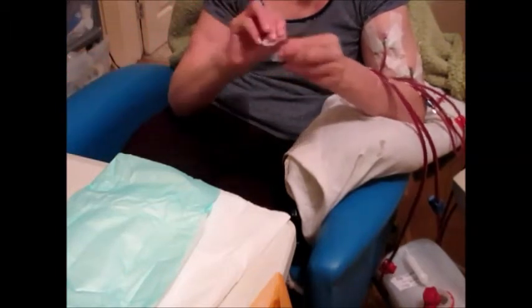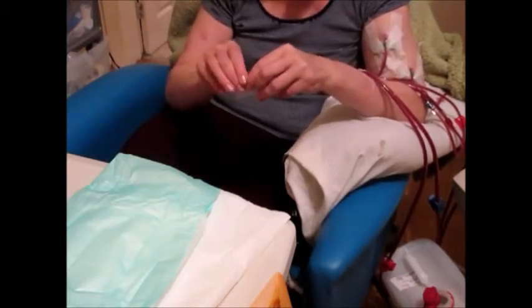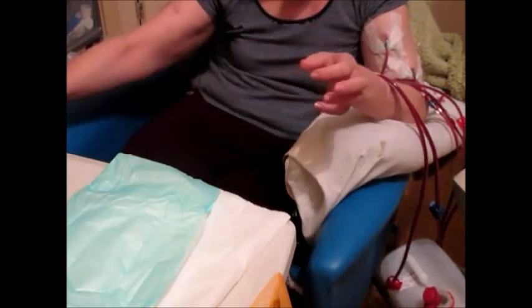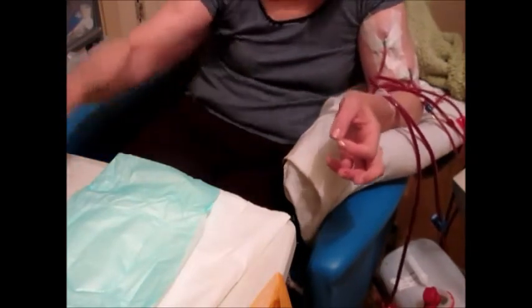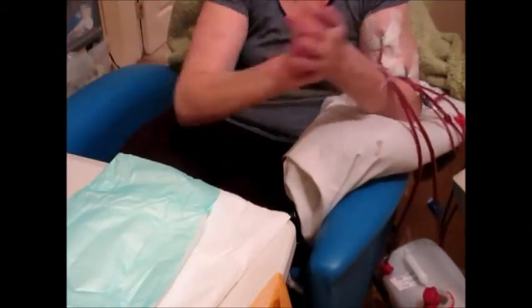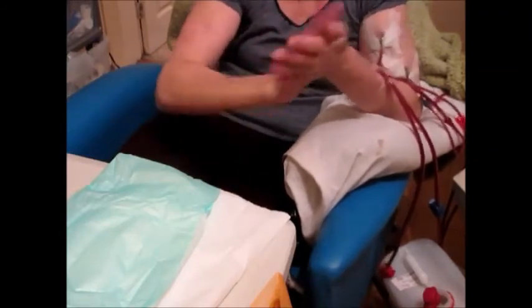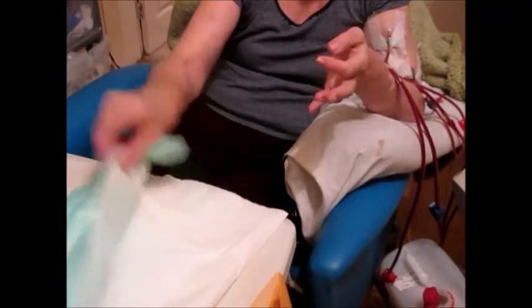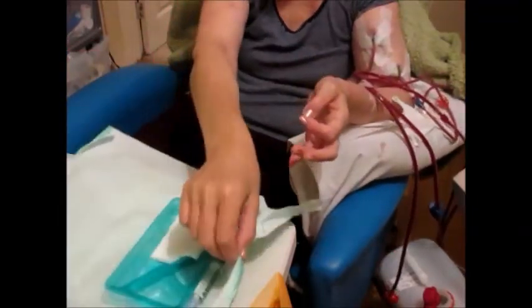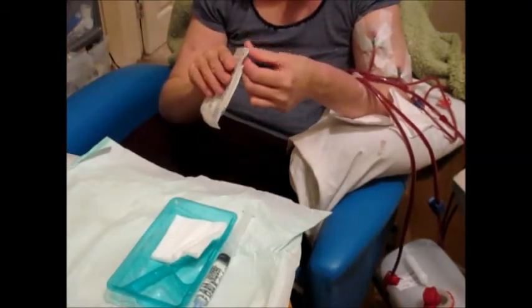And also a smaller piece to actually make the swab when you've folded it over. I'm just going to open the pack and then put the dressing towel underneath my arm.